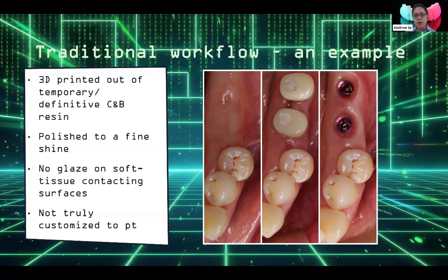So it's not a bad idea if you don't have anything and you don't want to do your own design work. This is all pre-made. You can make a whole bunch of these in advance and then just sterilize them or autoclave them and then pick the one that you want to use on the day. I think it's not a bad option for many users out there to get started in some basic CAD, well, more like basic CAM.